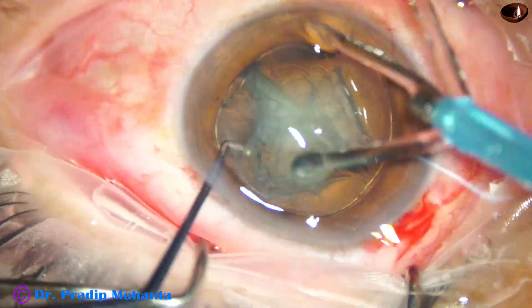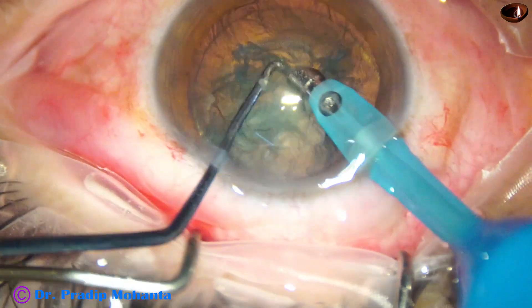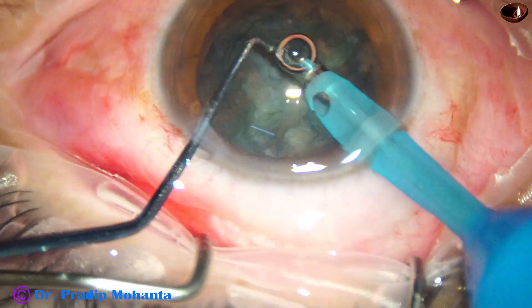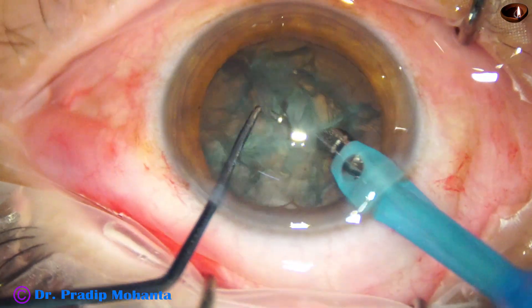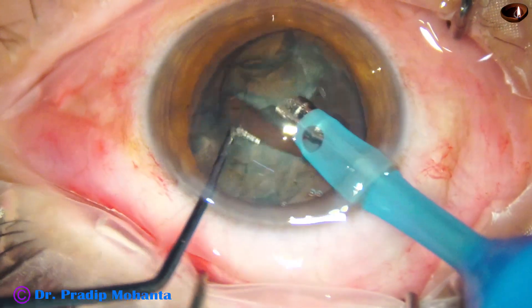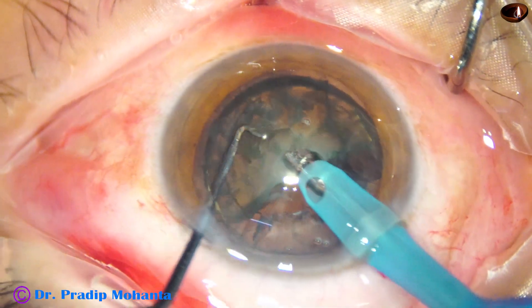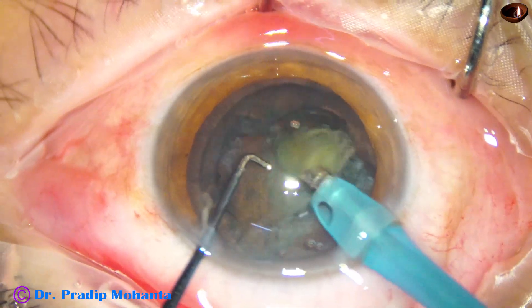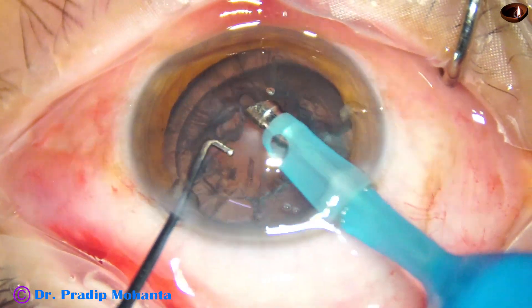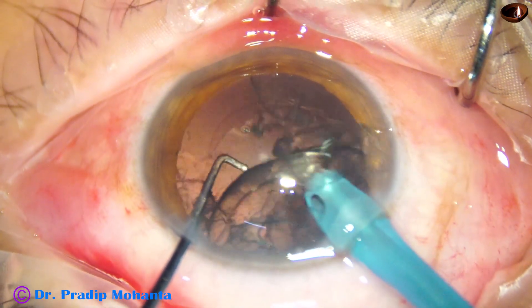Now here goes the handpiece. Each hemi nucleus is further chopped into smaller pieces by the nucleus sustainer. You can easily support the hemi nucleus and chop. The nucleus is managed, and now the epinucleus comes easily.